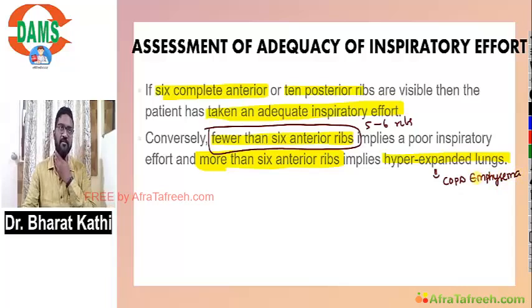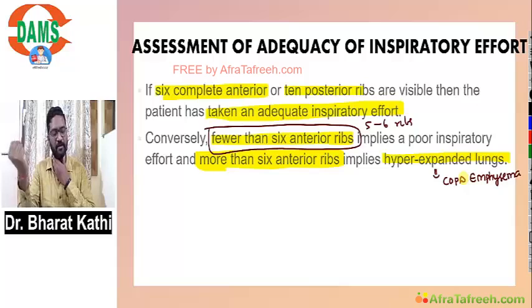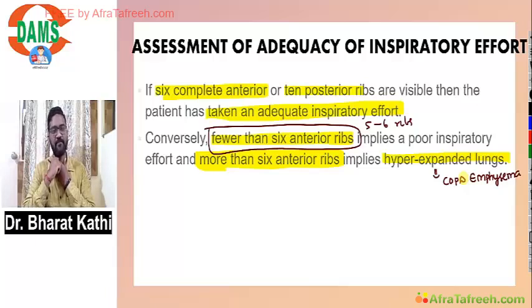So when we discussed the case of emphysema, I told you the findings in the PA view. We have also discussed the retrosternal distance. Just go through the case, or at least the PDF of the emphysema case discussion. There we have discussed all the radiological findings in detail.